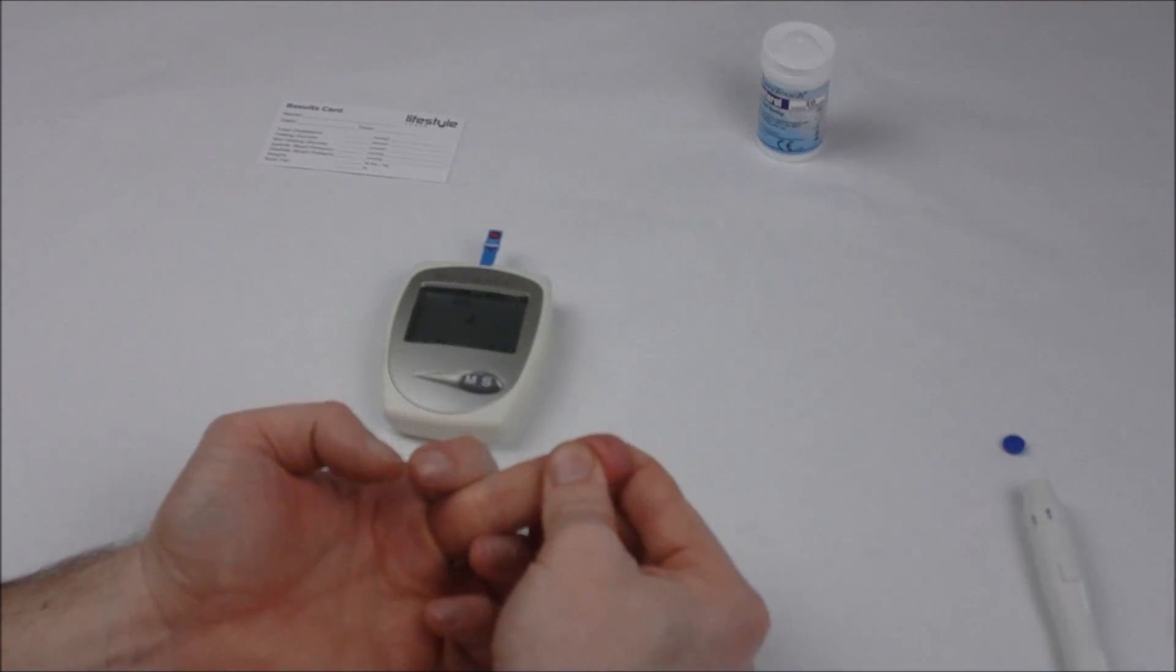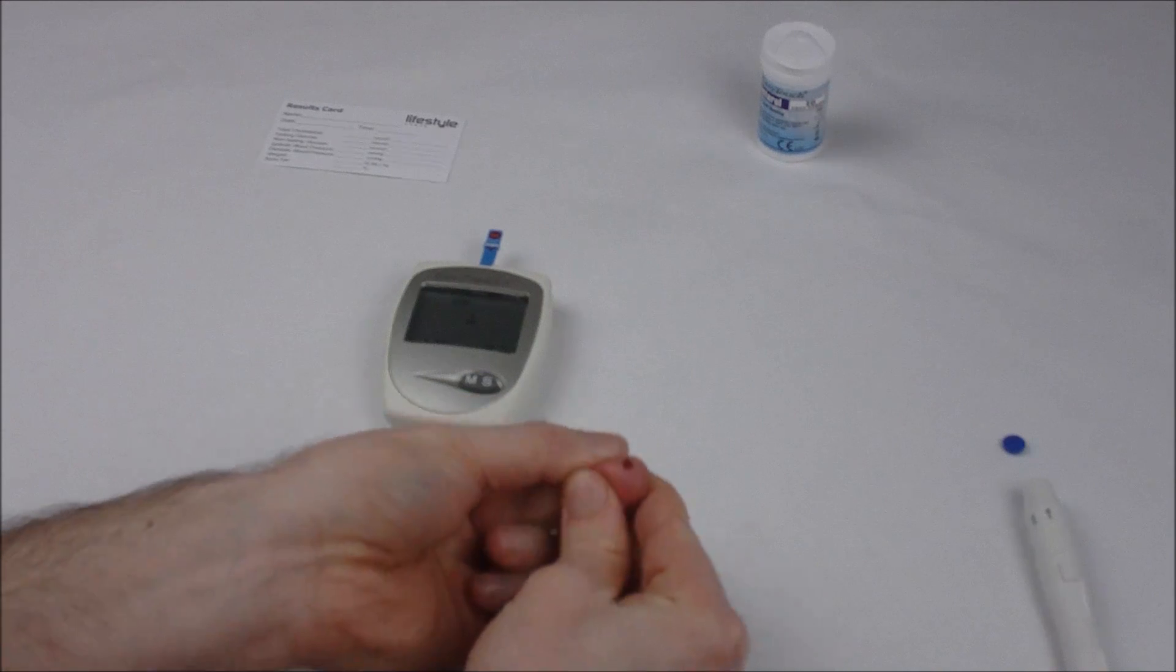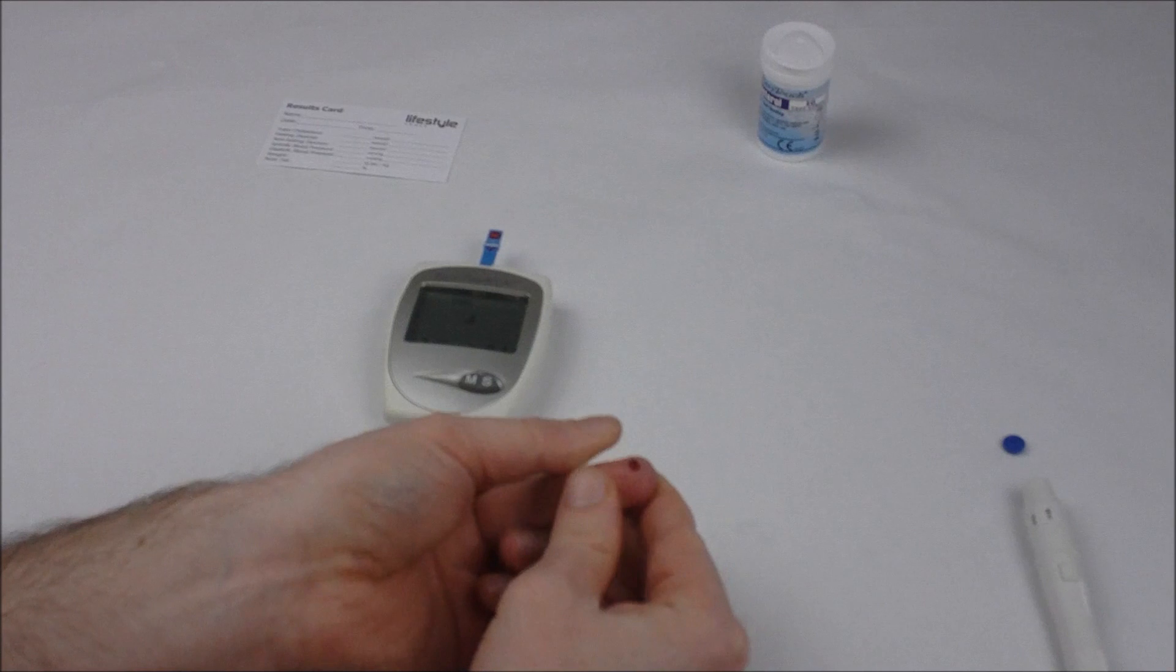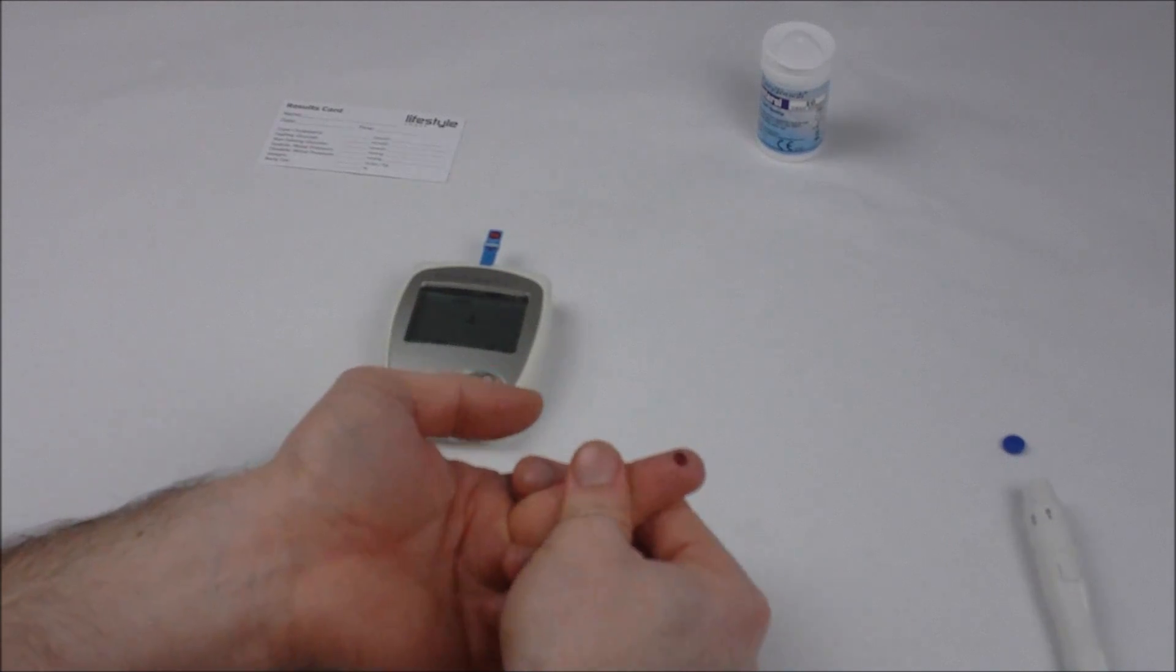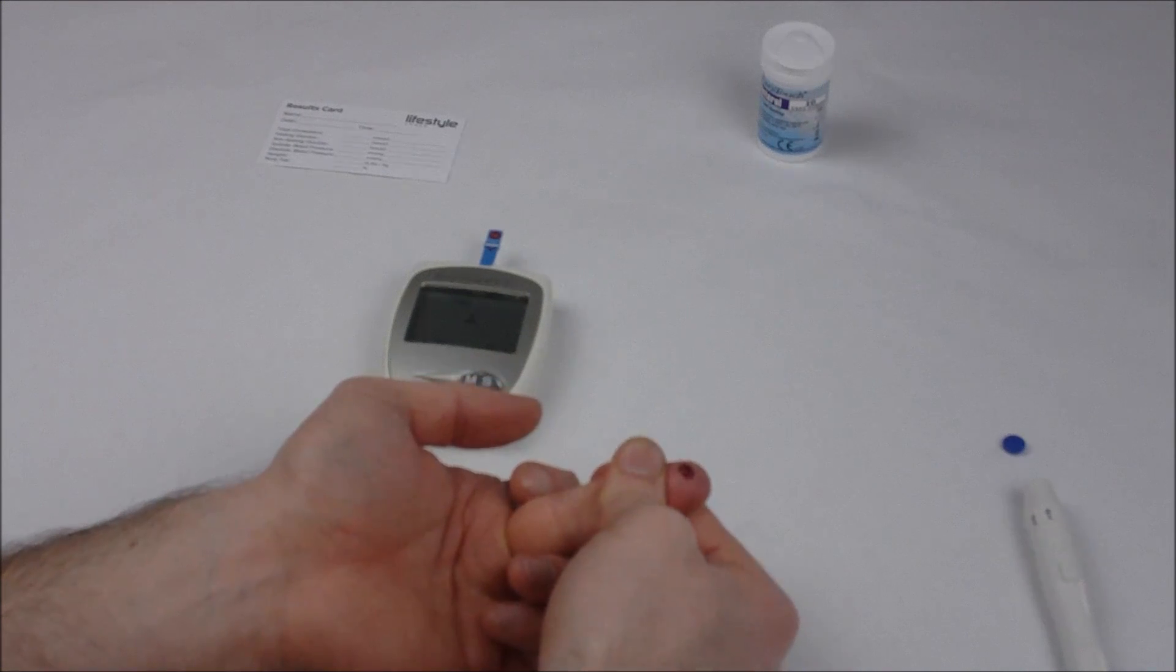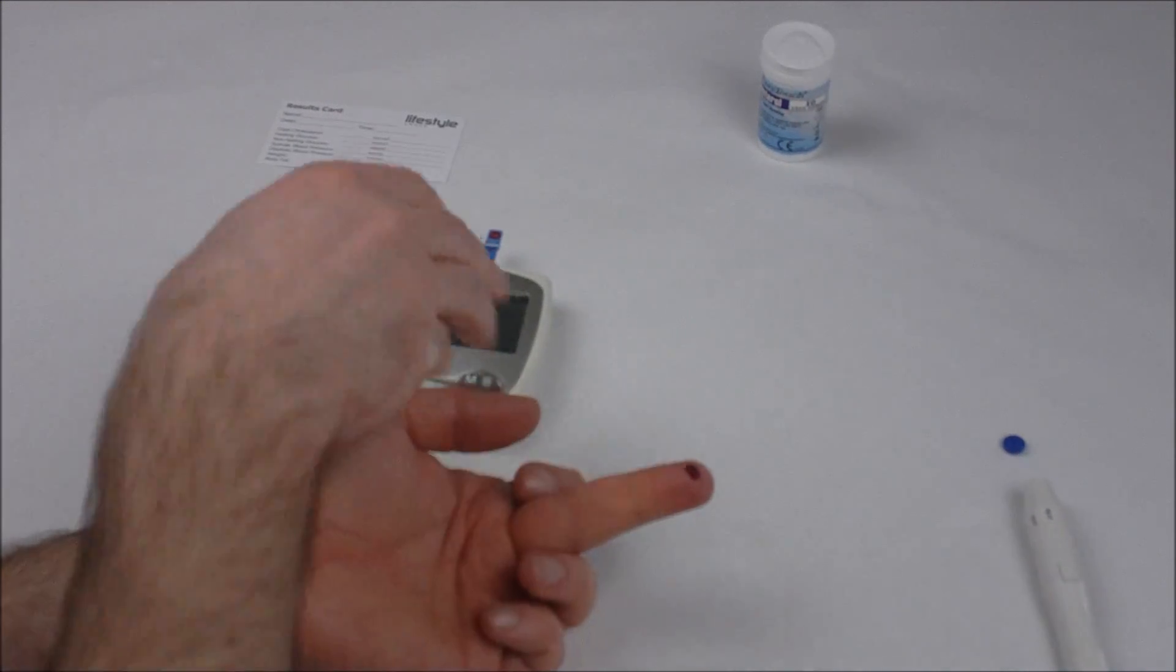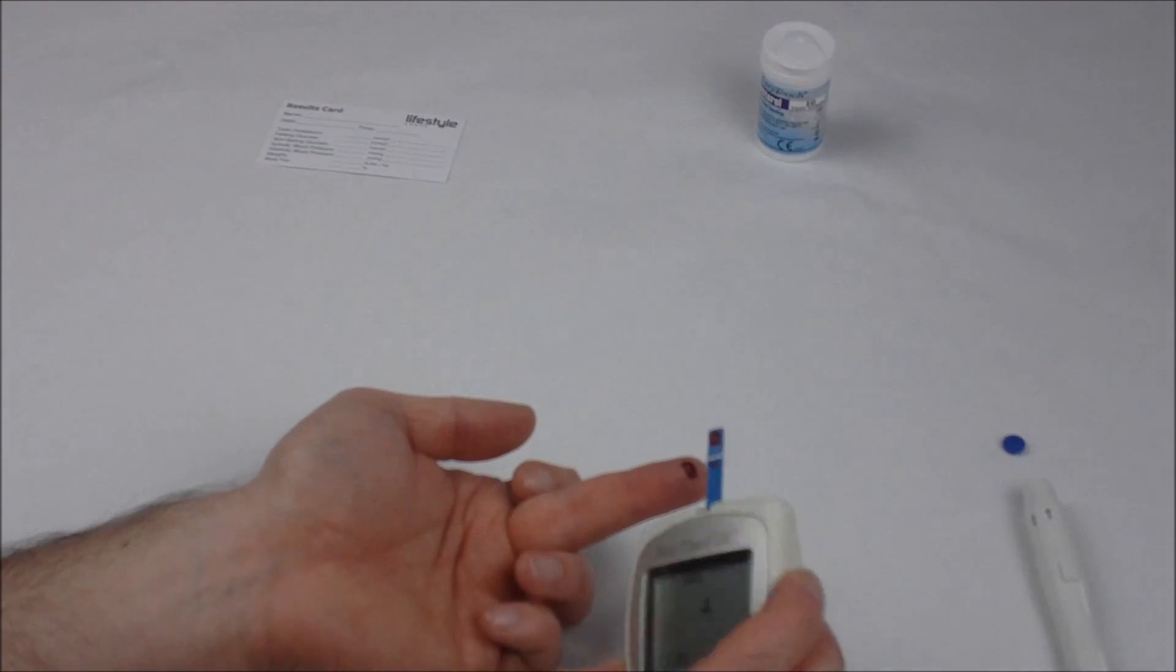Put your lancet pen to one side and allow your finger to bleed. Try not to squeeze too much. If you need to squeeze, do it from further down here. That will help ensure you get a good blood supply, and once you've got a big drop grab your monitor.